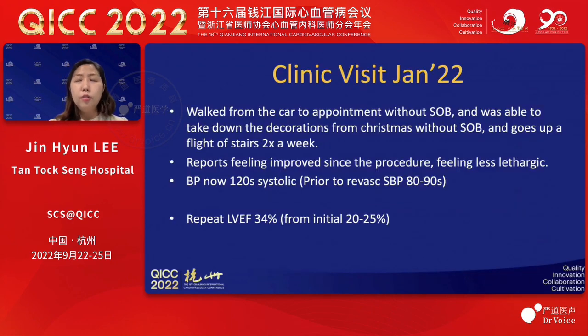The right heart cath readings were okay post-procedure. The patient was weaned off the Impella CP on table, and he was discharged after a few days. On clinic visit 1 month later, he was found to be much better. He could walk from the car to the appointment without any shortness of breath. He was able to spend his Christmas, and he can go up a flight of stairs twice a week.